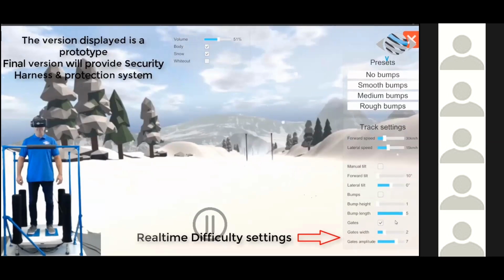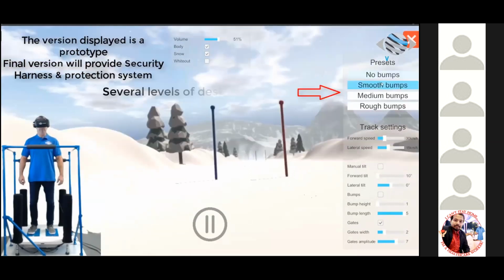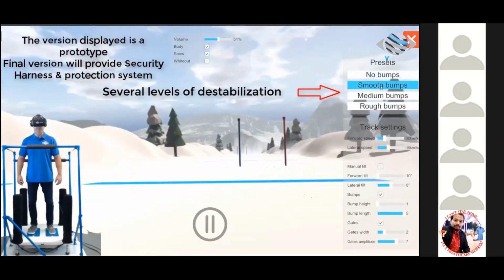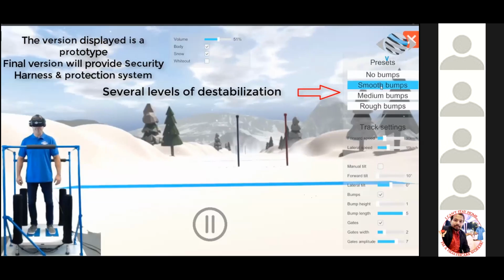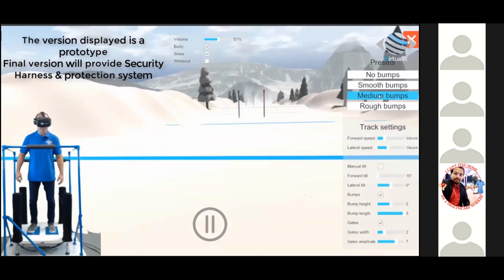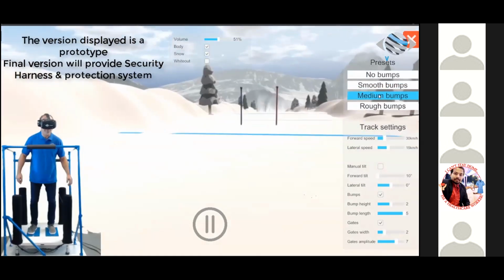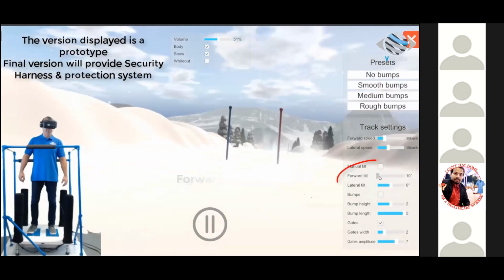So for patients, playing while doing rehabilitation is another key to all kinds of rehabilitation, not only vestibular rehabilitation, because of the motivation of the patient to come and do the rehabilitation sessions, but also because they're not thinking, I'm doing this, it's dangerous, I could fall, or it could bring any pain or anything. No, they're just focused on what we ask them to do.